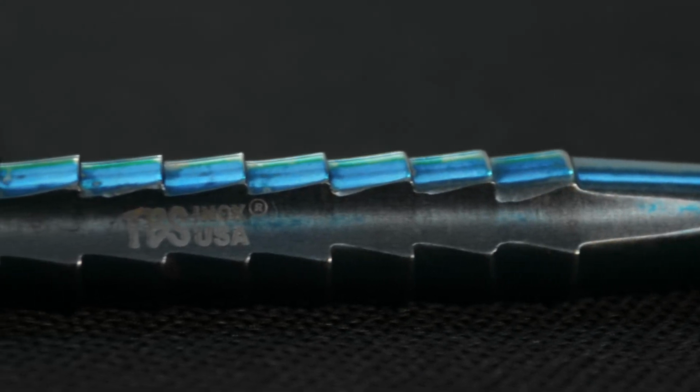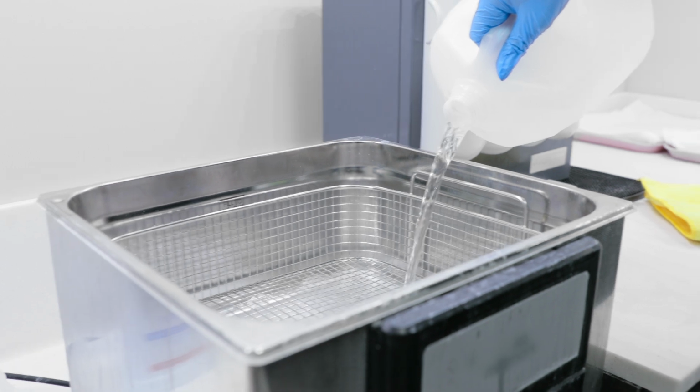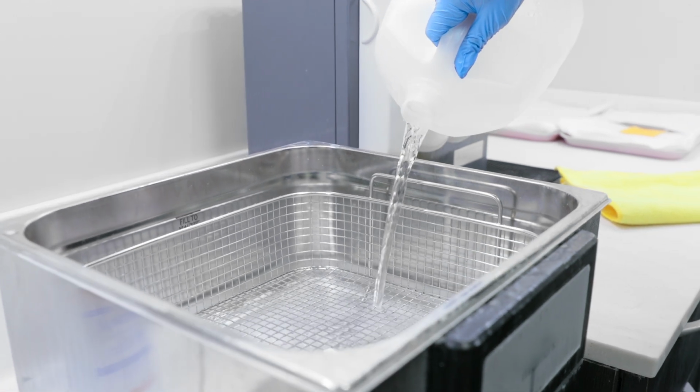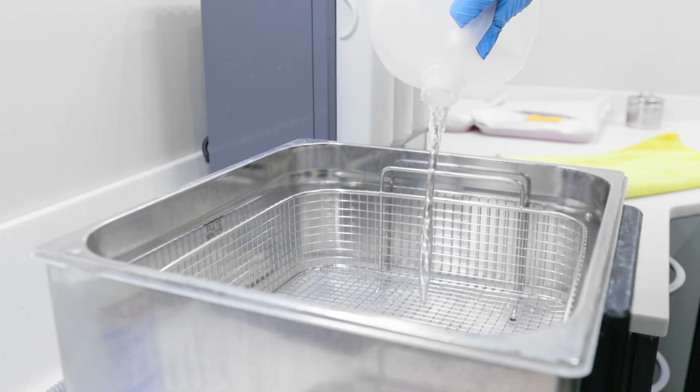We recommend changing ultrasonic solution every day when it comes to cleaning surgical instruments. This ensures that the potential for cross-contamination of instruments and instrument sets is reduced to a minimum.